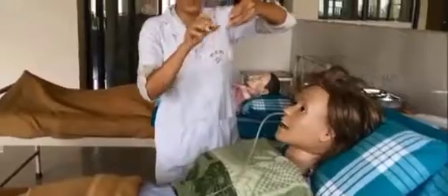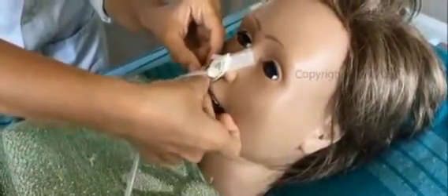So this is like a butterfly shape. The base that remains, we keep secure on the nose, and cover it. Then the 2 split ends we open and cover in the opposite direction. So one on the other, in the opposite direction, we cover it and fix it. So that is the fixation on the nose.